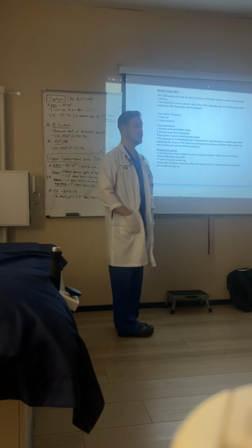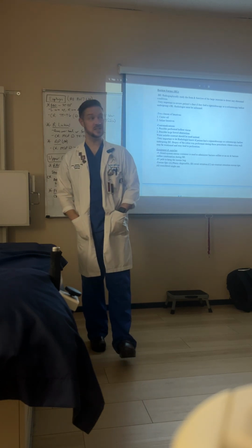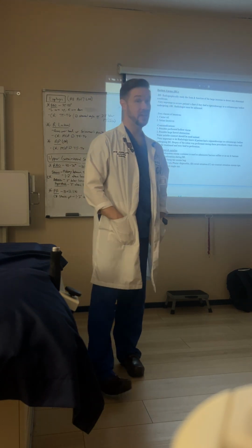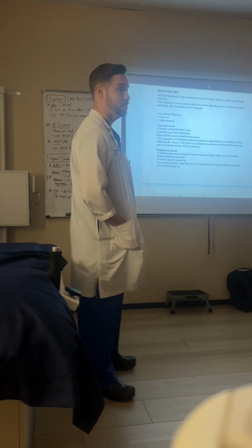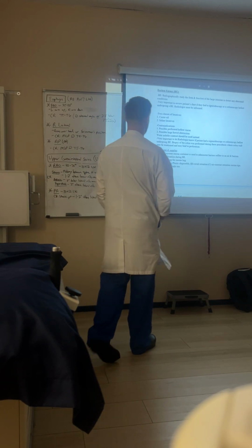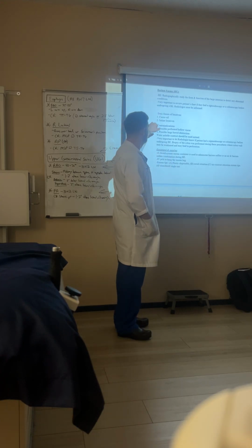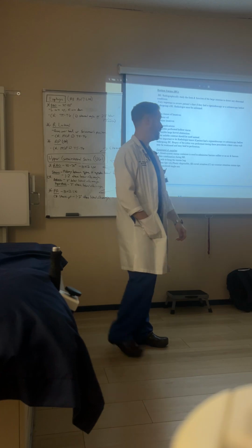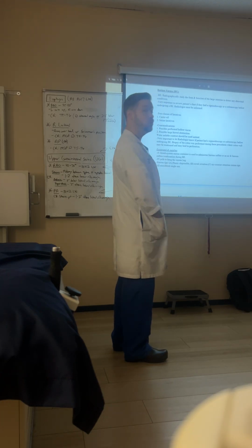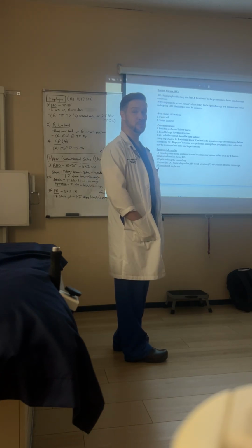Because if there's any poo-poo left in the large intestine, it's going to look like maybe something abnormal. So, two classes: castor oil and saline laxatives. I'm going to make sure that bowel is nice and clean and clear of poo-poo. I like to say poo-poo like that, it's funny.